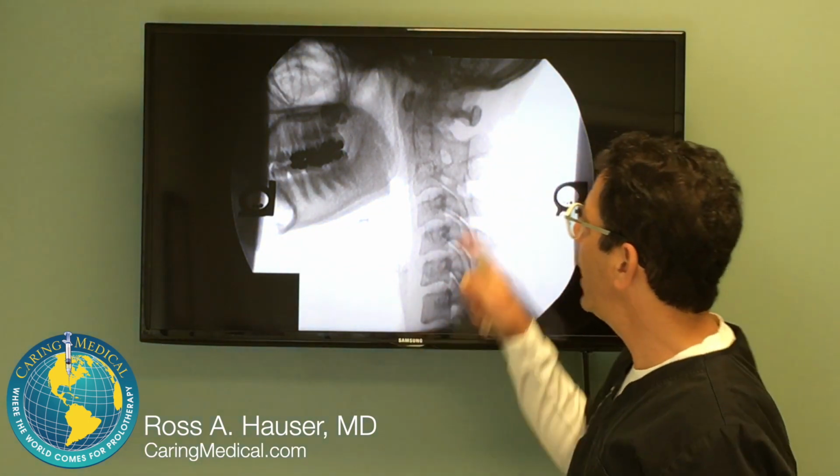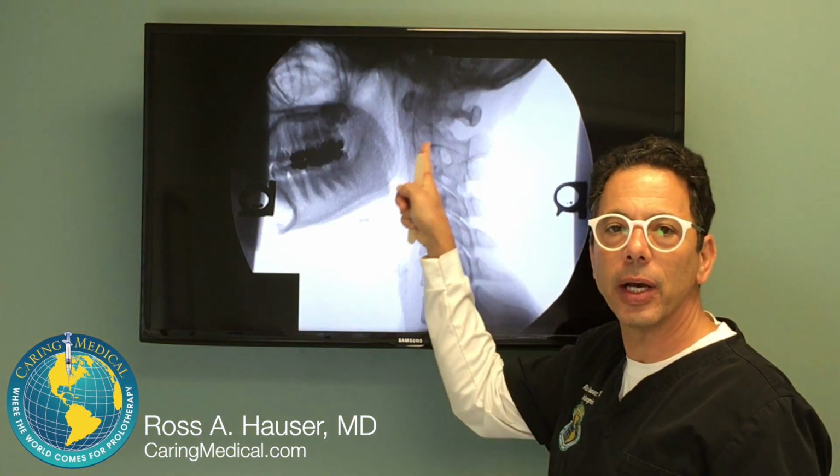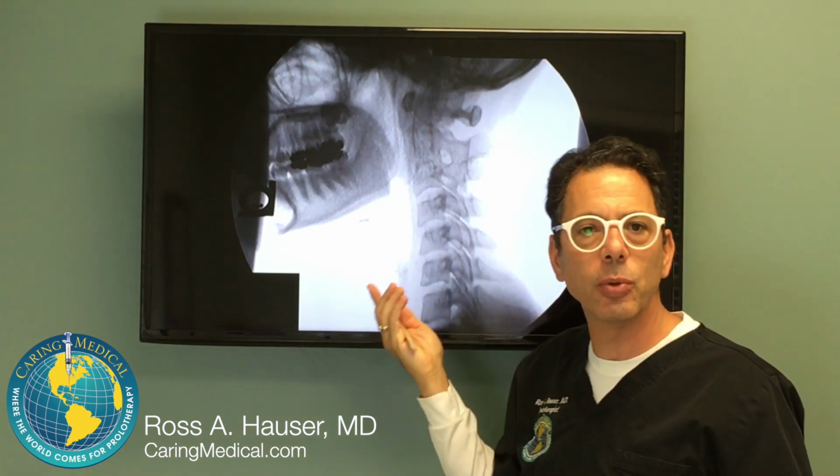One of the things about digital motion x-ray is almost every time we scan somebody, we find something you couldn't actually predict. Now, Brittany had lots of chiropractors taking care of her, and none of them ever said that she had a congenital fusion. And what you're going to see here is at the C2, C3 area, she has a fusion. She was born that way. She didn't know that. So during the average day for her, this area can't move, like it's fused.